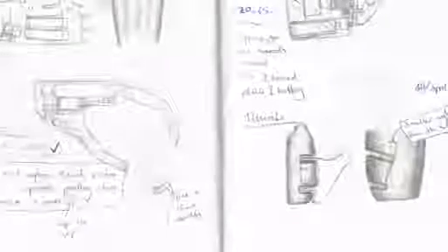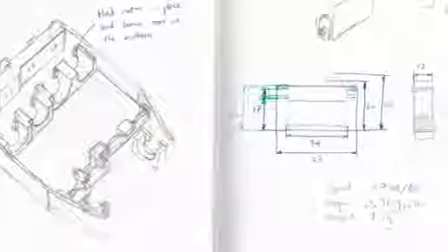I've always been interested by the human hand, so from a robotics perspective, it's a very complex part of the human body. And I found, as a roboticist, I wanted to try and replicate that in a way that gave somebody comparable functionality. So we can demonstrate how this would work on an amputee, because I have the same muscles that an amputee would. They just wouldn't have the hand.